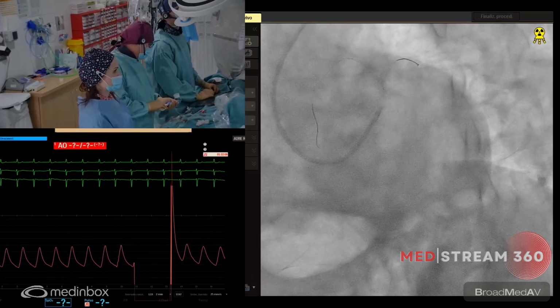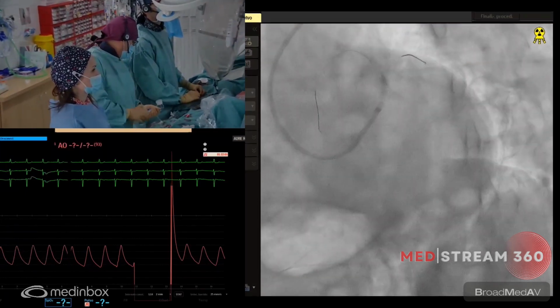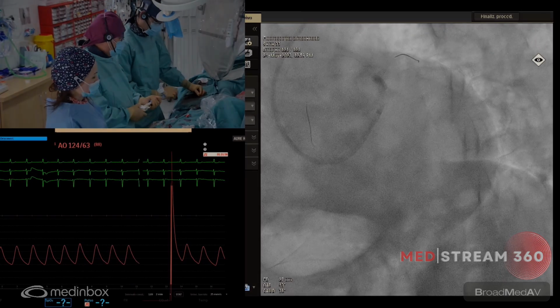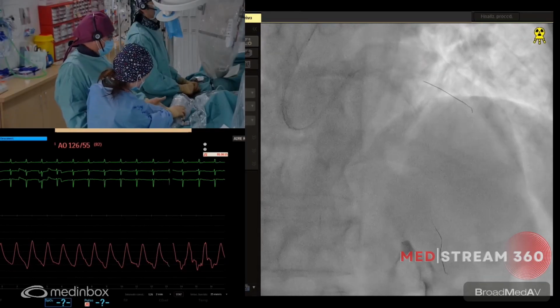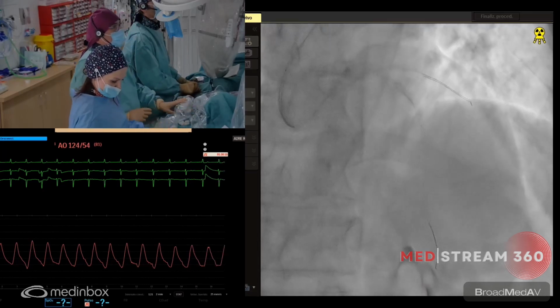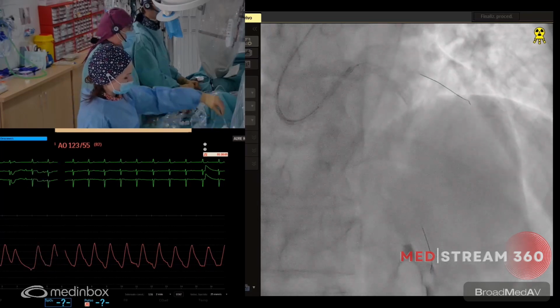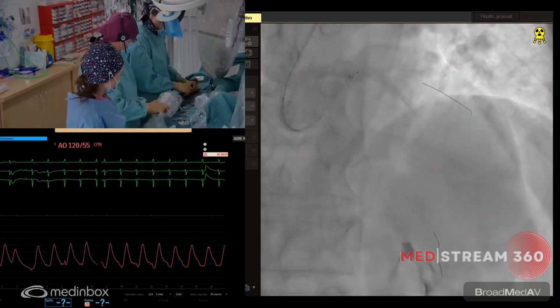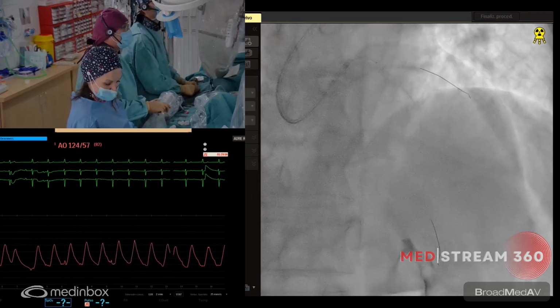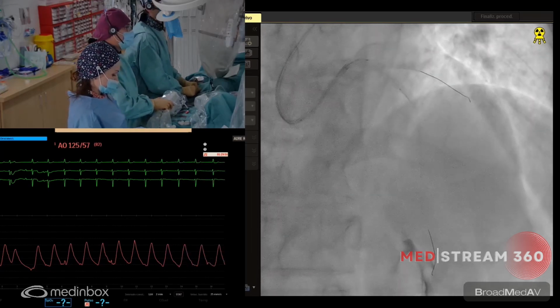I'm there, okay? Blood pressure is okay, ECG is okay. Let's retrieve the balloon. Test, please. All diagonals are there. So it's interesting to use OCT after the plaque modification technique to know if the result is fine. But if you want to save some contrast and you see a very good expansion in two orthogonal projections after NC balloons, after lithotripsy, probably you can skip this step and go to the final OCT if we can cross it.